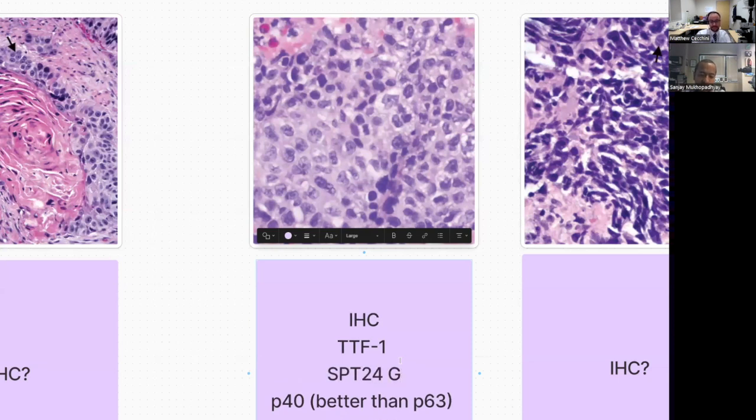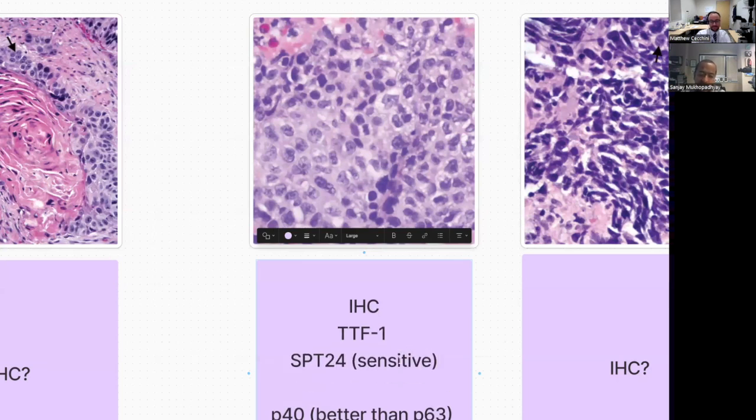SPT24 is the sensitive clone, and 8G7G3/1 is the specific clone. I always forget the exact name. 8G7G3, slash 1. Too many G's.